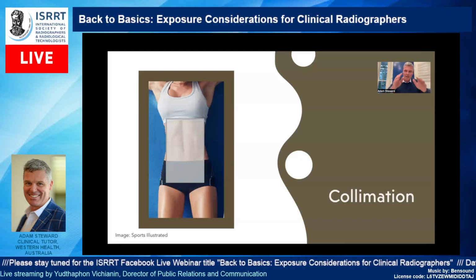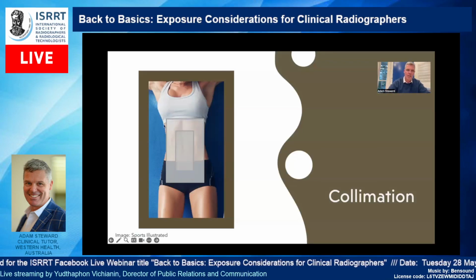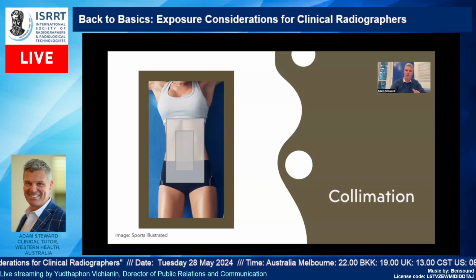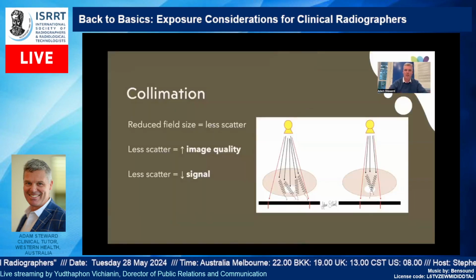We can't do that. They're just moving in the direction, right? What we're basically doing is we're no longer utilising any of these photons out here. So the photons here make no difference. The primary beam is still going to come through exactly the same. The only difference is the scattered photons from here that were incident in this area will no longer be there. And for that reason, when we collimate more tightly, we reduce the scatter radiation, okay?